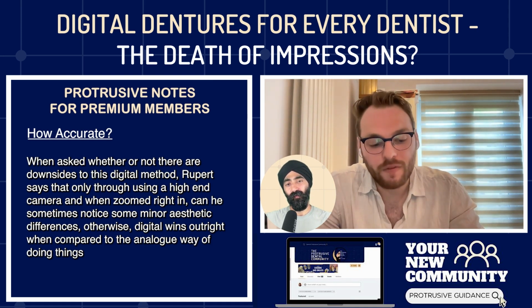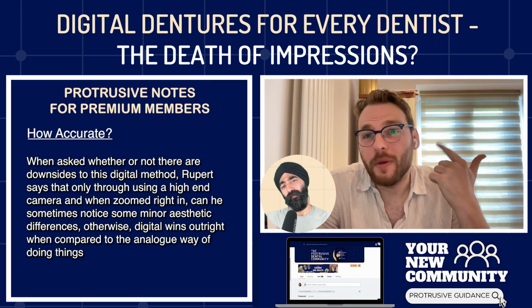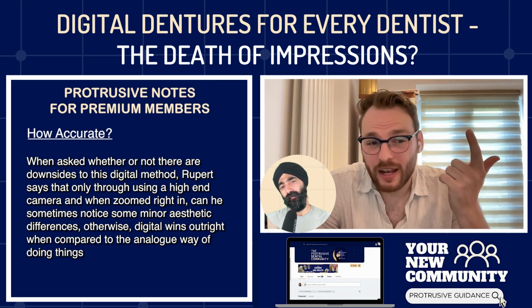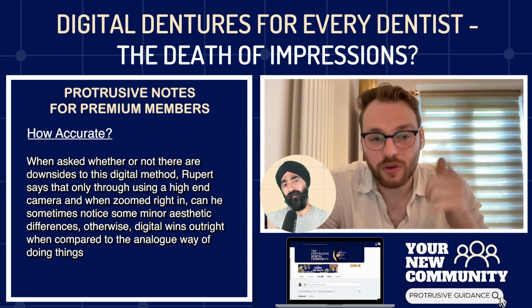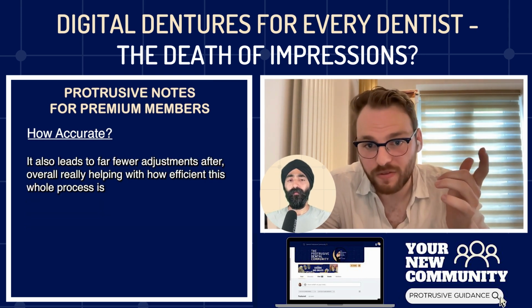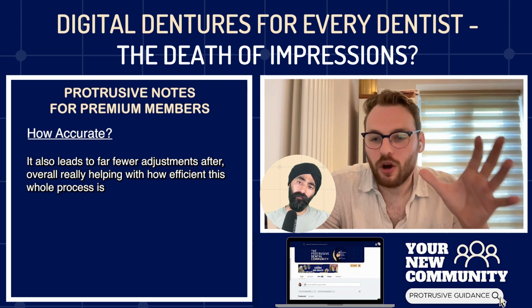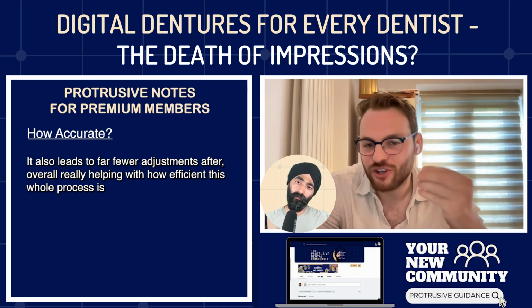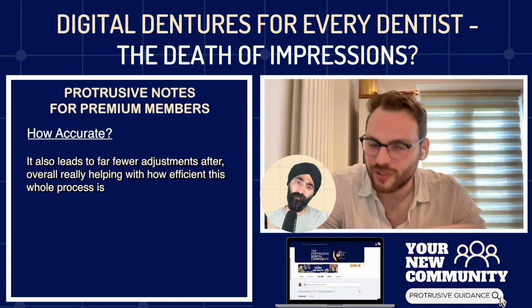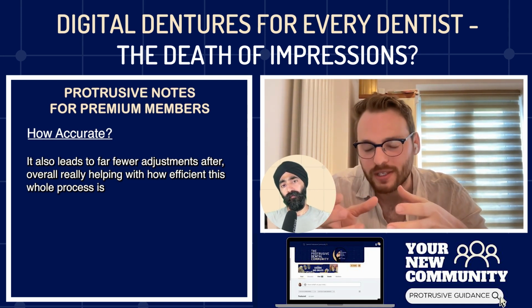So clinically for me, much fewer adjustments of the fitting surface, usually none. The bite, again, very rarely do we even need to adjust the occlusion at all. As long as your try-in was fine, your fit is going to be fine because it's a perfect replication. So you're not doing the whole investing of the wax, melting it away. The teeth might shift a fraction. You put the acrylic in, that distorts. You've not got any of that. So there's no real tweaking of the position of the teeth.